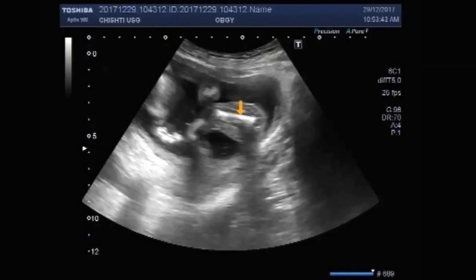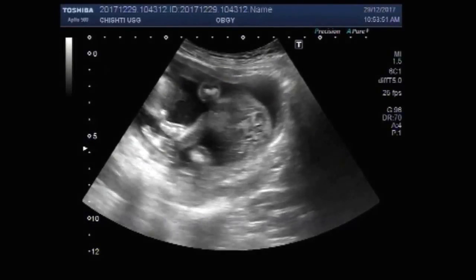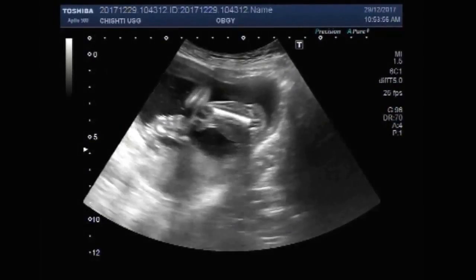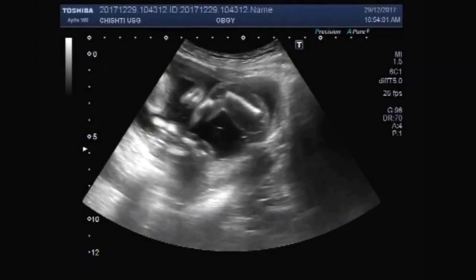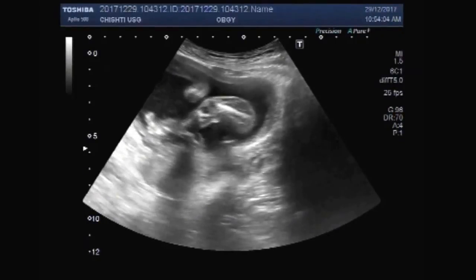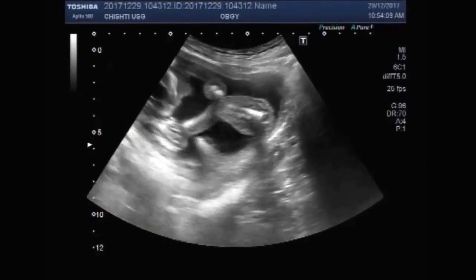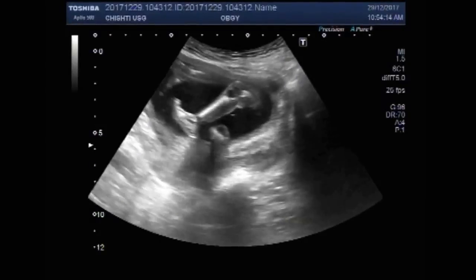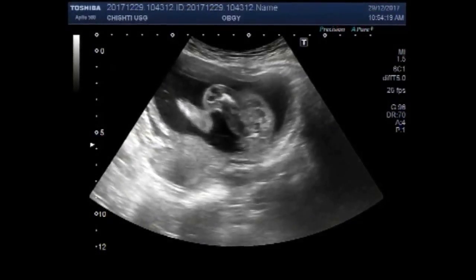This is the fetus. Again, the leg of the fetus — the other leg is crossing.